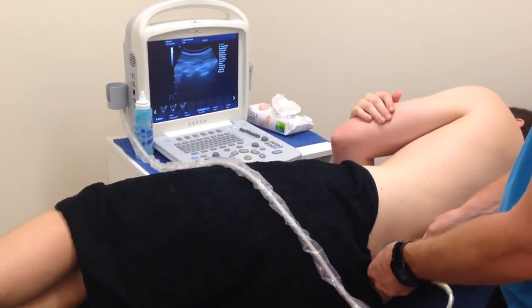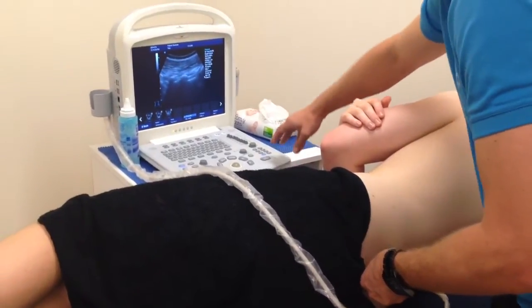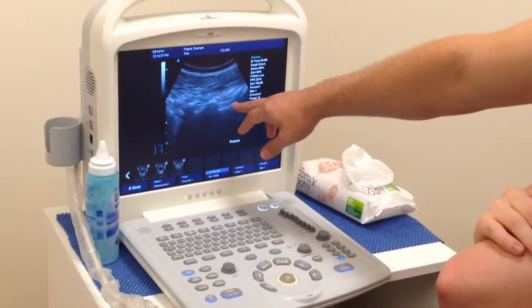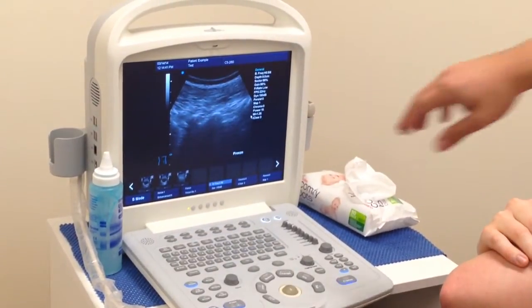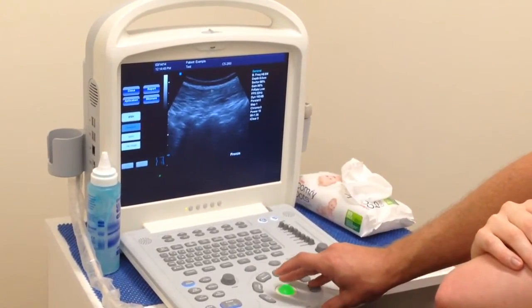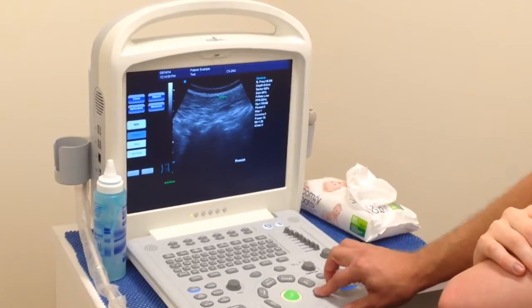So here in this position, what we're looking at is the middle of the screen. I'll just freeze this here. The middle of the screen here is the L4-5 facet joint, and we've got the L5-S1 down here, and L3-4, etc. moving up. The distance, or the cross-sectional area of Multifidus, is from here at the top down to the facet joint here.